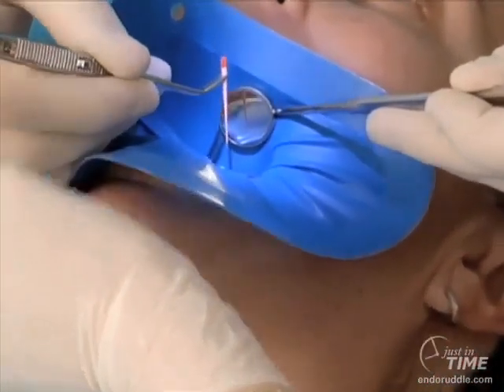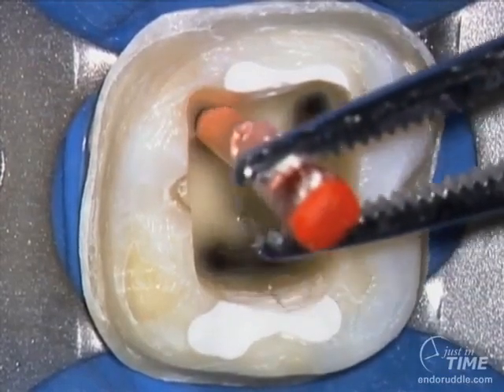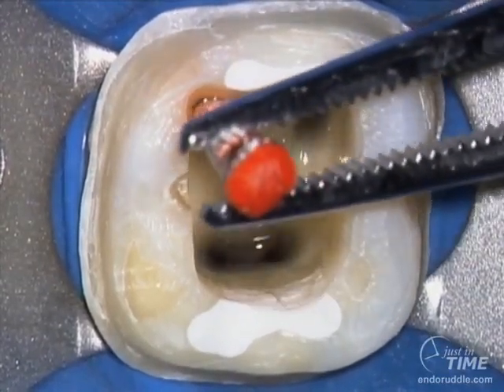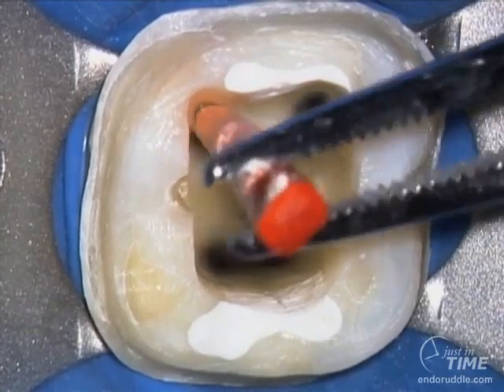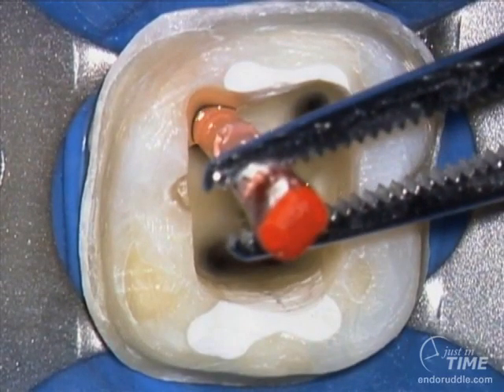I'm using red. Oftentimes you can use yellow. If yellow goes to length, oftentimes I'll try red, and red will oftentimes be maybe at length or just a little bit short. But whether you used a red-headed cone or a yellow-headed cone, the point is ProTaper has matching gutta percha points, and these are used and pre-fit prior to packing. With the cone fit, of course, we would radiographically confirm it because that would confirm all the operative steps to date.